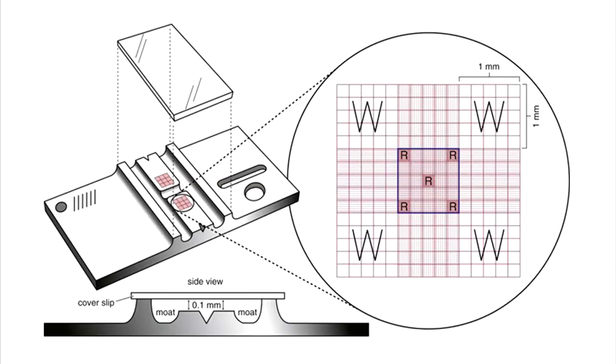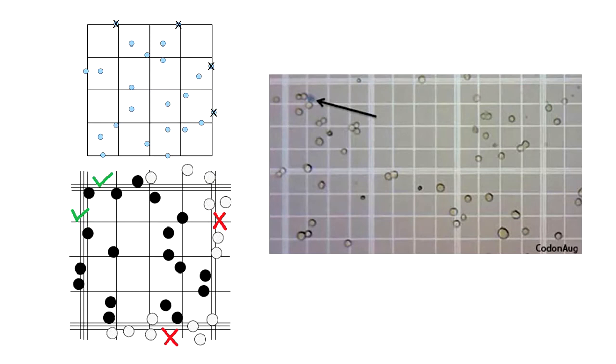When you look through the microscope, you will see the chamber with four corner squares to count. To count precisely, it is important to understand the rules of limit lines or boundary rules. The triple lines outline the size of each square.